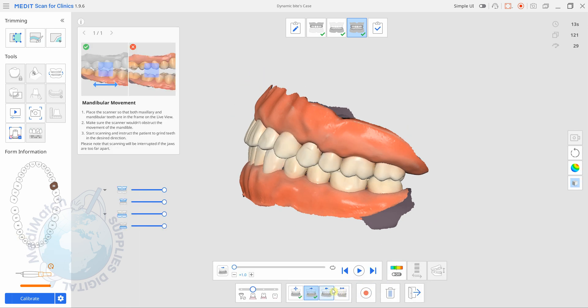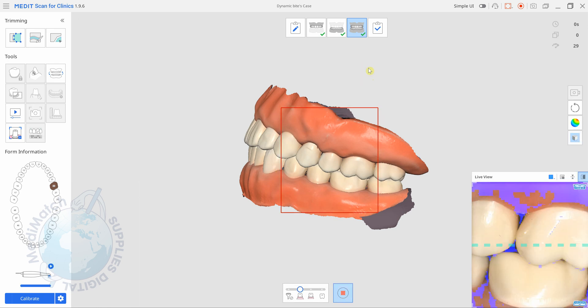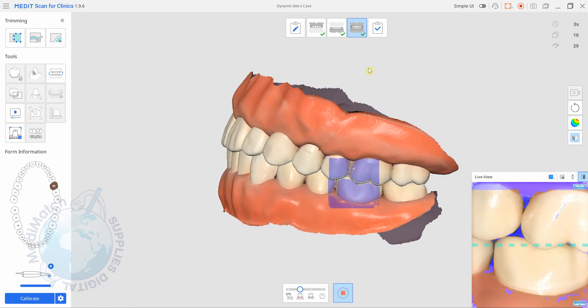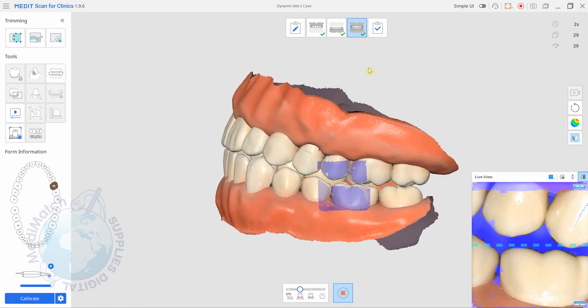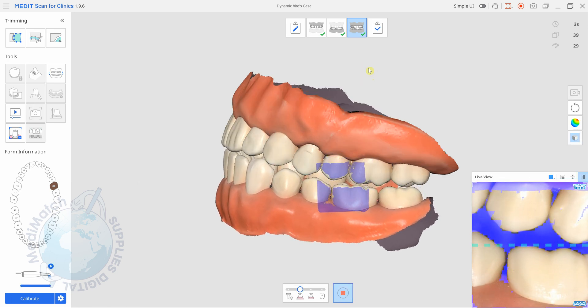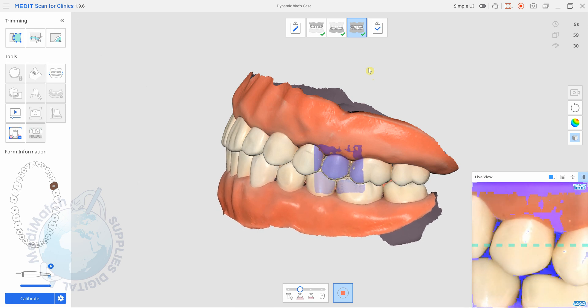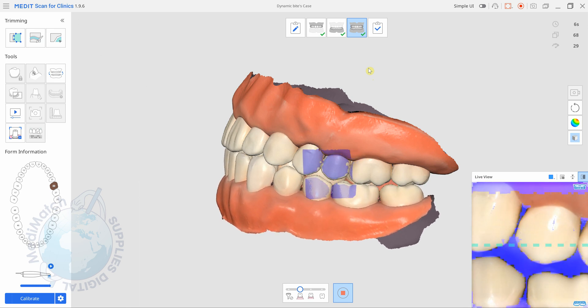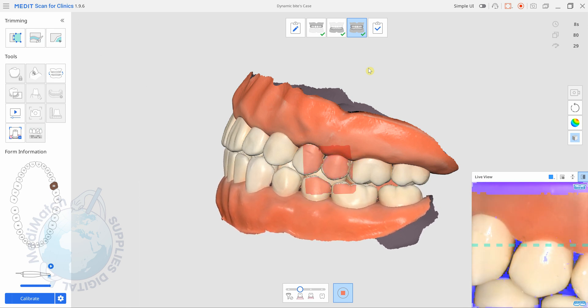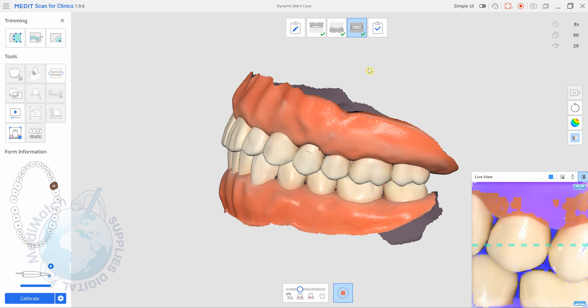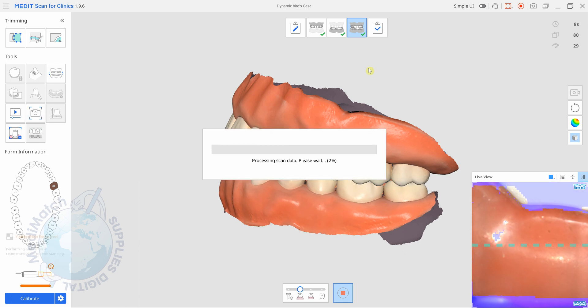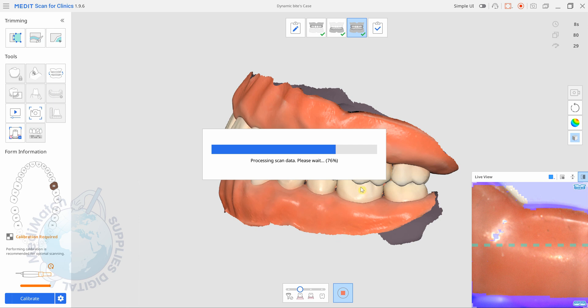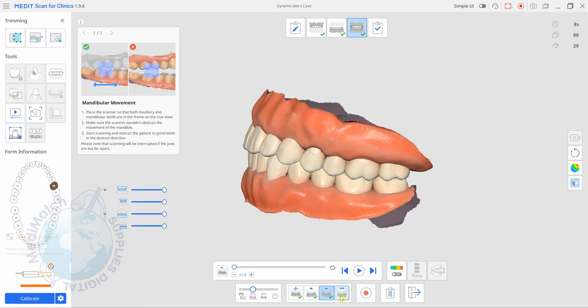We'll do the right side now. Okay tap the button, let it process and then finally we'll do the protrusion.